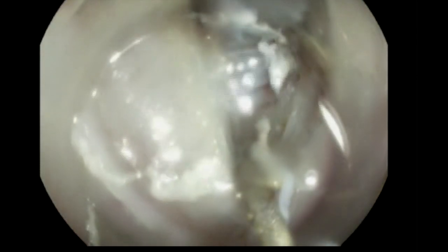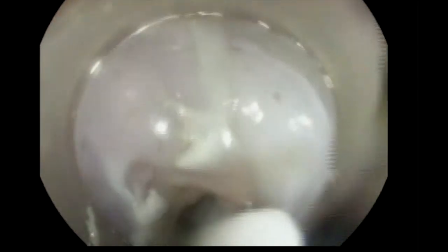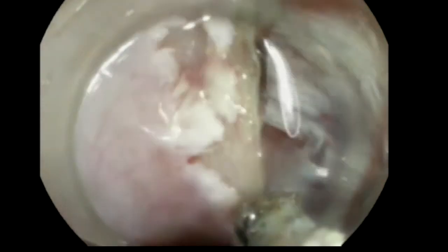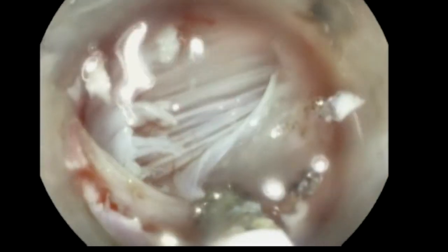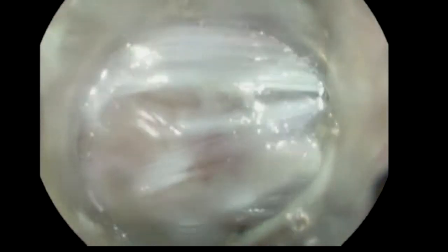The first thing we try to do here is to extend the tunnel a little bit. You really don't want to extend it too much — maybe a tad and this will be enough. But you want to focus in this situation on clearing the submucosa on the side. I know this is counter-intuitive. We always feel like we want to expand the mucosal cut, but you don't want to expand your incision longitudinally. You just want to go to the side and continue to dissect the submucosal fiber at the edge of your incision. As you see here, we are just dissecting the submucosal fiber in the rim of the incision.